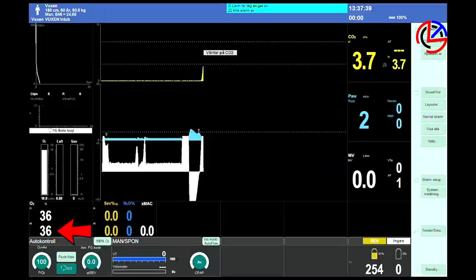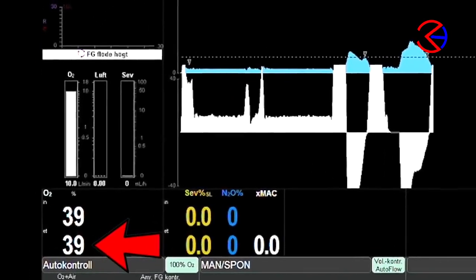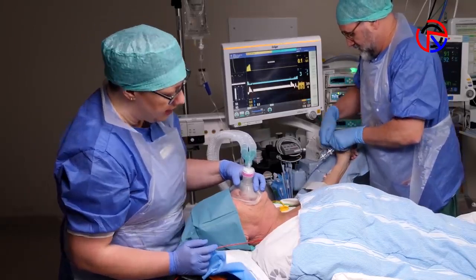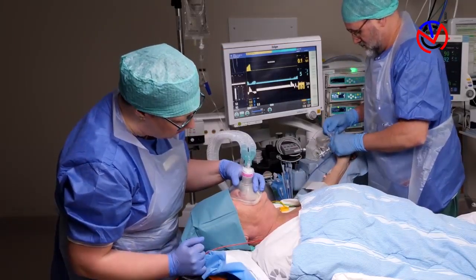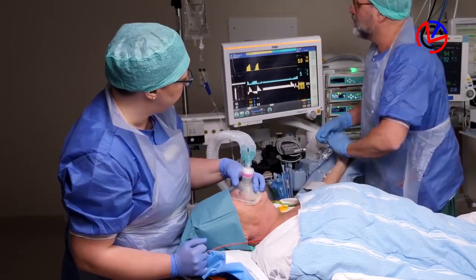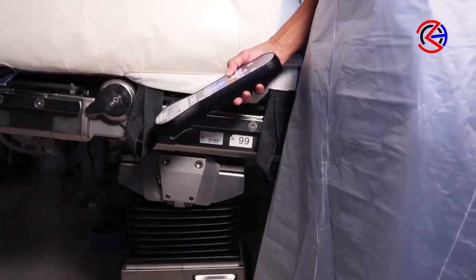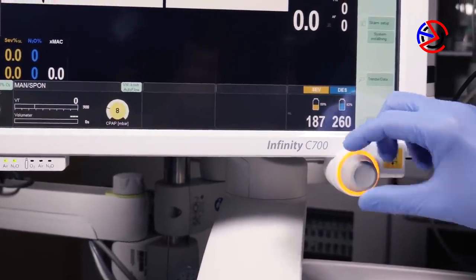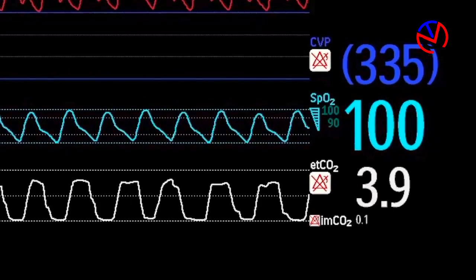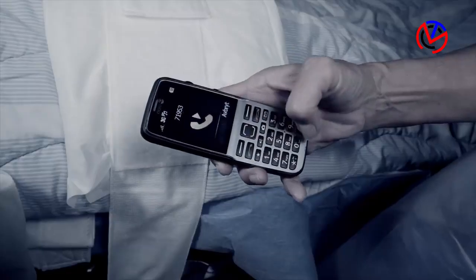When the measured expiratory or end-tidal oxygen concentration exceeds 80%, you have loaded up an oxygen reserve in the periphery of the lungs. If this monitoring is unavailable, pre-oxygenate for a minimum of 3 minutes. Pre-oxygenation can be further improved, especially in the obese, by tilting the table and by applying a positive end-expiratory pressure. This extra oxygen in the patient buys you potentially life-saving time if you have unexpected airway difficulties. Precious time to call for help or try more advanced techniques.